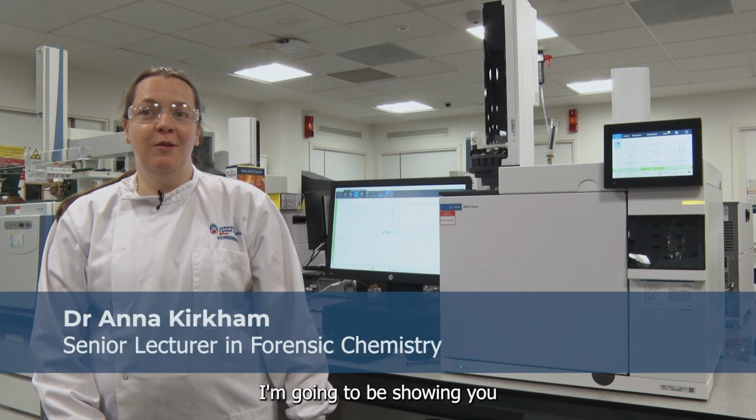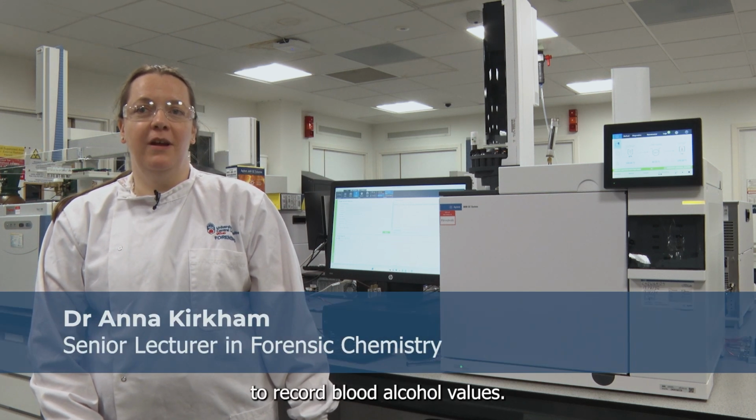I'm going to be showing you how to use the GC to record blood alcohol values.